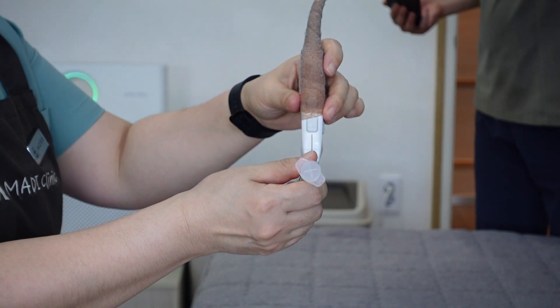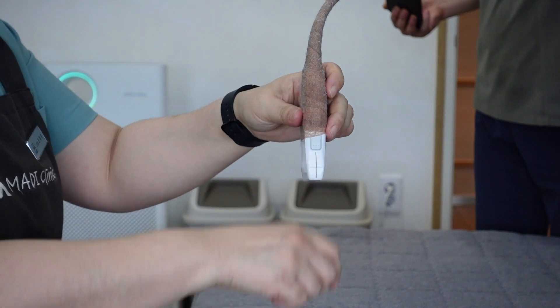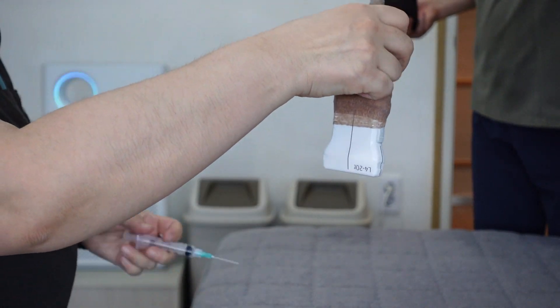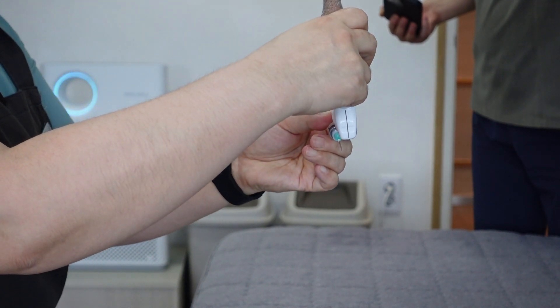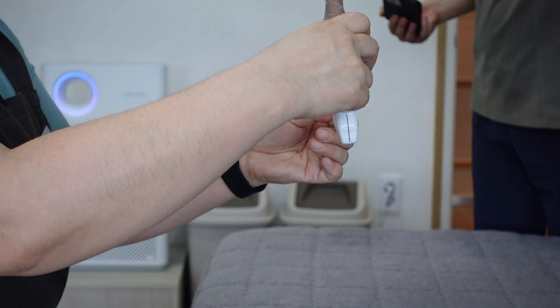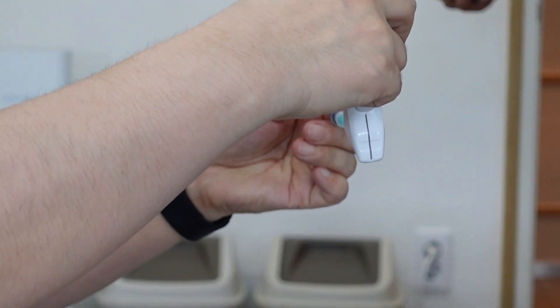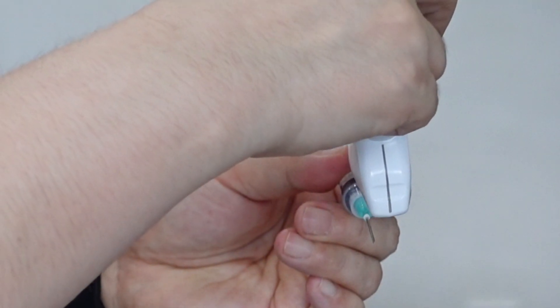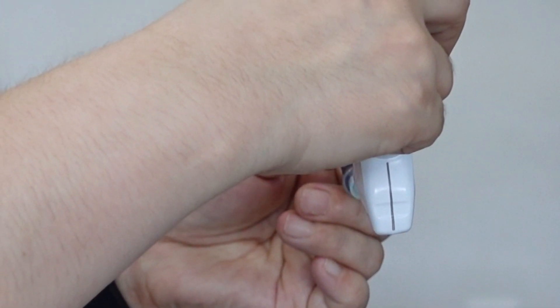Unfortunately, in this instance, her right hand obscures the needle. However, we can observe this in our second volunteer. Next, we'll watch the needle entering from the far side. For a more detailed observation, I will magnify the image. You may notice that the needle appears to deviate towards the operator's side as it passes the ultrasound probe, resulting in it being off-center.